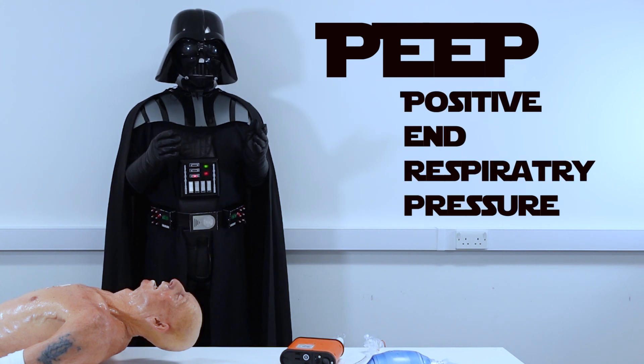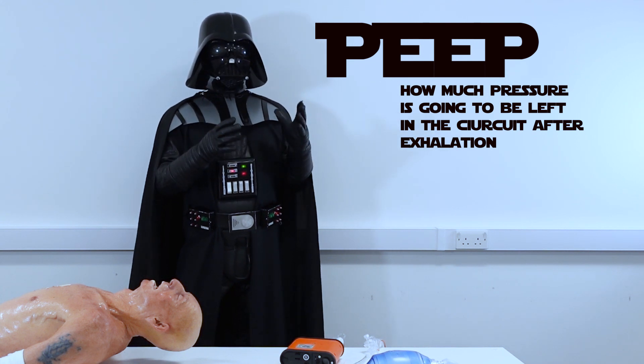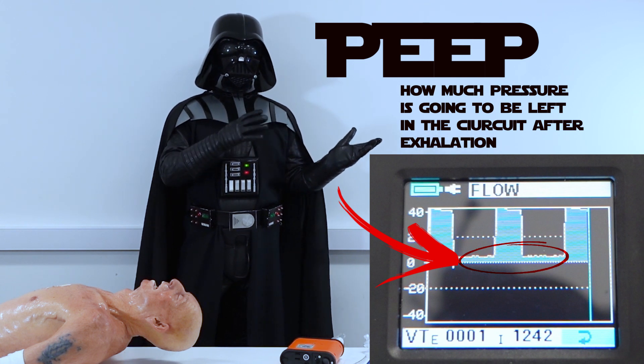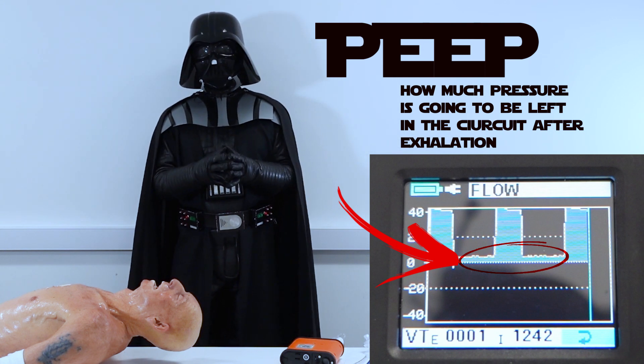PEEP — positive end-expiratory pressure — is how much pressure is going to be left in the circuit at the end of expiration. PEEP helps us to recruit alveoli: the higher the PEEP, the more alveoli you can recruit and the higher the oxygenation. Usually it's set to 5 cm of water.